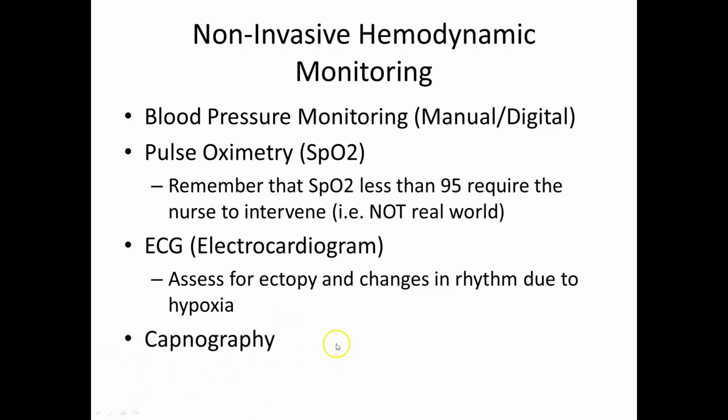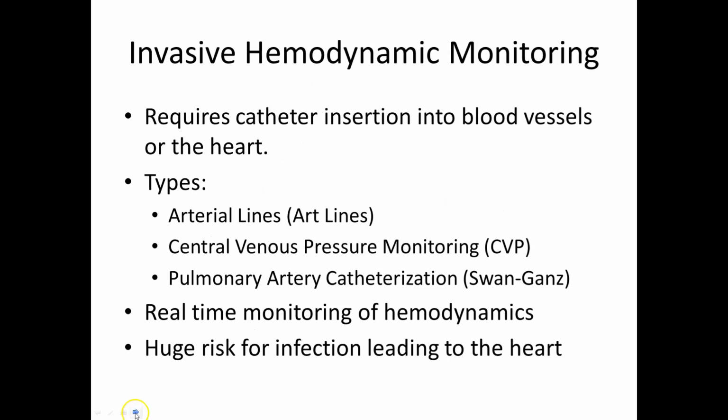We can use capnography. That will not be on the cardiac test. Hopefully you learned a little bit about that in the respiratory unit. But that's going to be typically for somebody who has issues with exhaling CO2, and especially if we have them on a PCA pump and it's a medication that could potentially depress their drive to breathe.